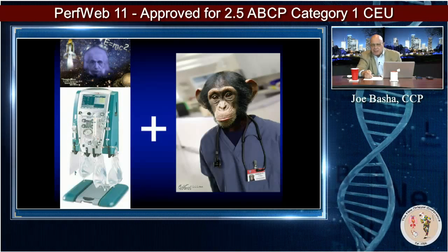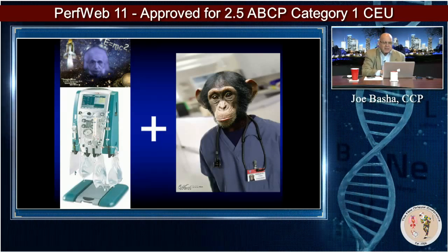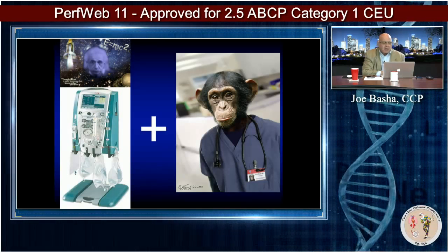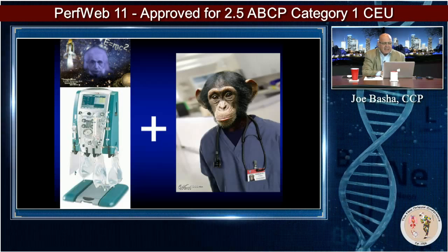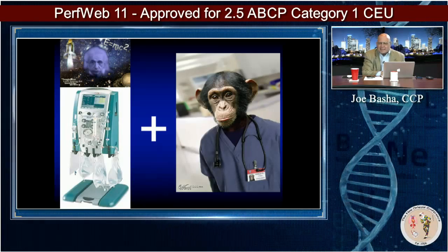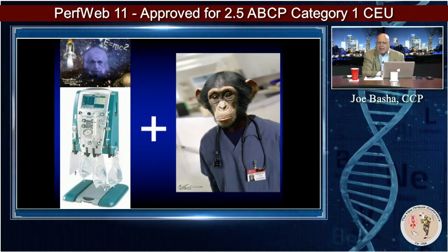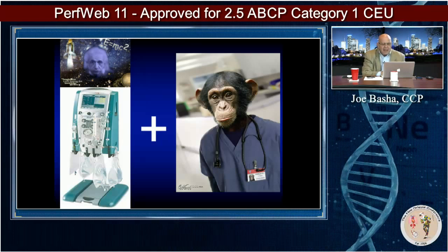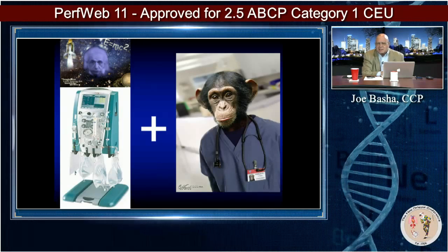It is a gravimetric device. And what that means is that each of those bags that you see down here are on scales. So you have replacement fluid bags here, and you have an effluent or waste bag here. And these are 5-liter bags. And all of these measurements, all of these weights, have to be equal so that if you're adding X amount from one bag and you want it to be zero balance, well, that amount had better be over in this bag by weight or the system is going to alarm.